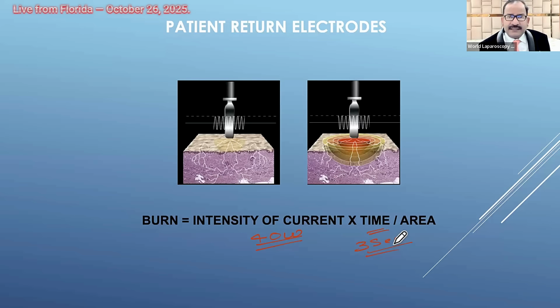At 80 degrees centigrade there are two chemicals inside the cell, elastin and collagen. Collagen, as you know, is a tissue binding protein. So at 80 degrees centigrade, elastin and collagen also melt. But if the temperature is more than 100 degrees centigrade, then this melted elastin and collagen will burn. And once it burns, it becomes like burnt charcoal, just like the tip of a burnt cigarette. And then it can drop anywhere and bleeding starts again.